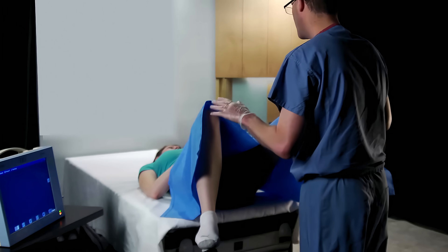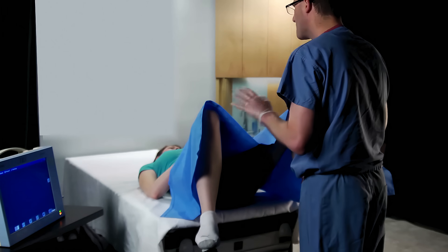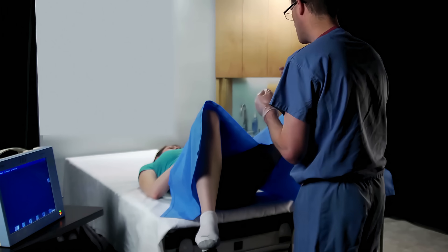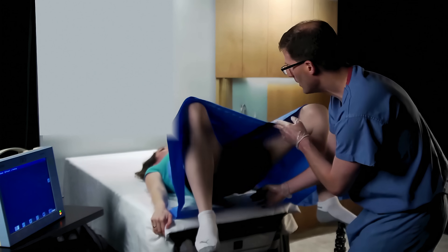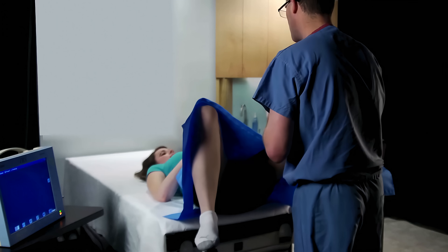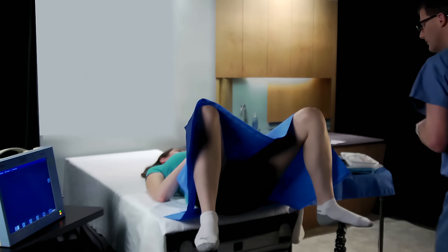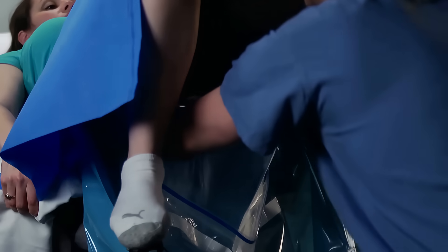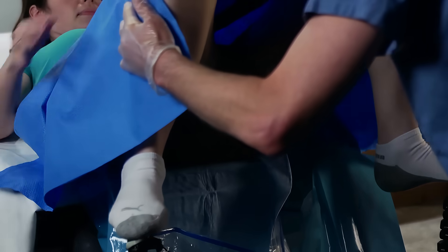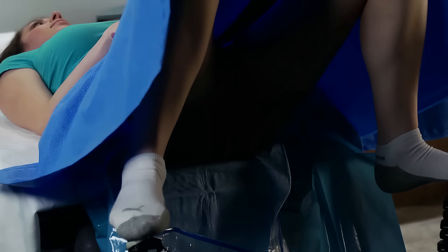The patient is then positioned on the examining room table. It is essential to confirm proper positioning so that the buttocks are slightly over the lip of the table. This allows for optimal range of motion with the hysteroscope during the procedure, such that the hysteroscope can access all parts of the uterine cavity and is not inhibited by the table. Additionally, any leaking of fluid from the vagina will travel into the buttocks bag rather than up the patient's back or on the table and be lost, which may interfere with the calculation of fluid deficit.